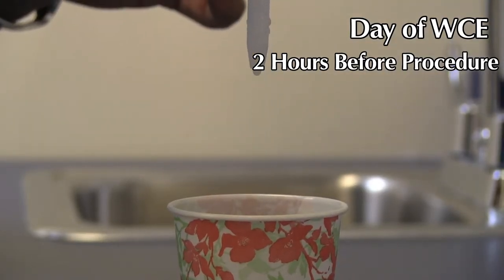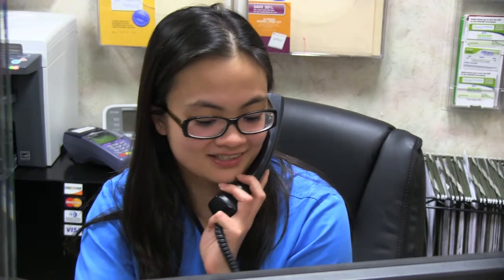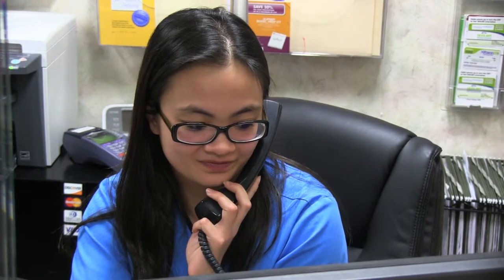If you take heart or blood pressure medication, you must take it no later than two hours before the test. The day of the capsule endoscopy, two hours before your test, take one Reglan tablet and two full droppers of Simethicone drops mixed in four ounces of water. Do not apply body lotions or powders to your abdominal area — the antennae leads need to adhere to your skin. Wear loose-fitting, two-piece clothing. After swallowing the PillCam, the capsule endoscopy procedure will last approximately eight hours. Contact our office immediately if you suffer from any abdominal pain, nausea, or vomiting during the procedure.